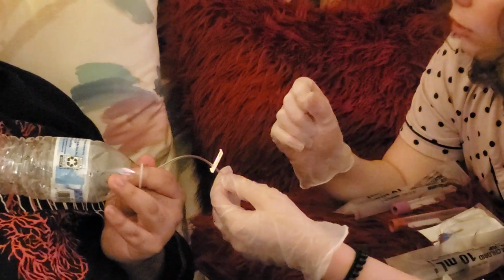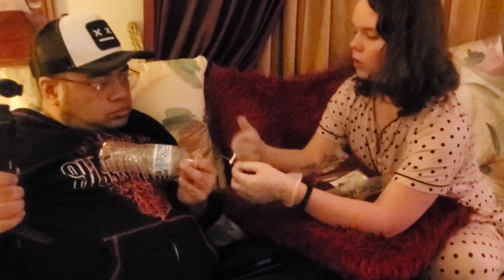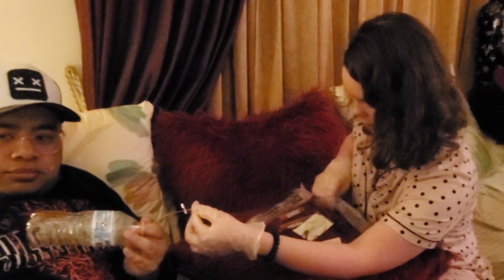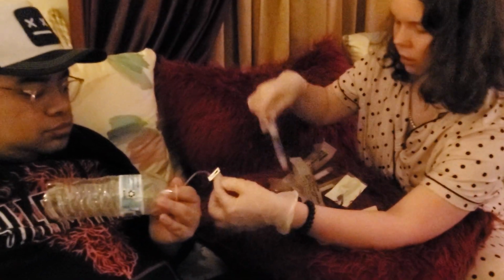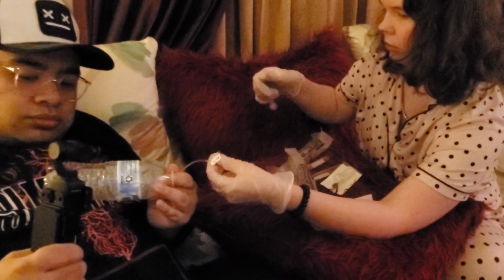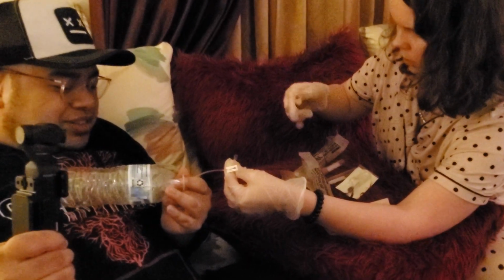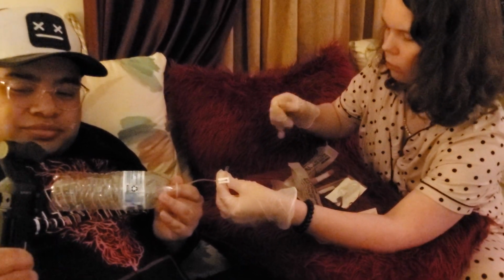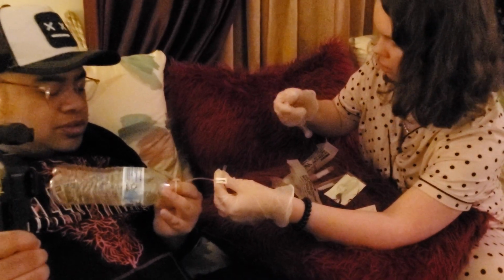Oh, with blood draw, I also want to make sure that I'm using the distal tube for blood draws. So I check which one is the distal tube. Clean the cap. I let it air dry. I'm going to grab this, my first flush. This is the most complicated part. I'm trying not to squeeze the tube so it doesn't block. Well, right now it's closed anyways. I mean, like, when you unlock it, I'm trying not to squeeze the tip here.